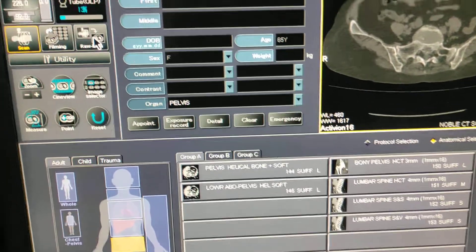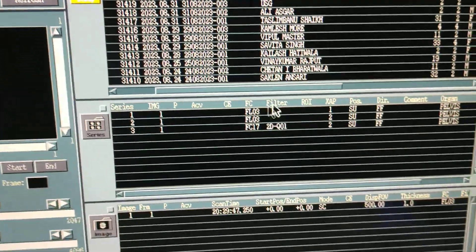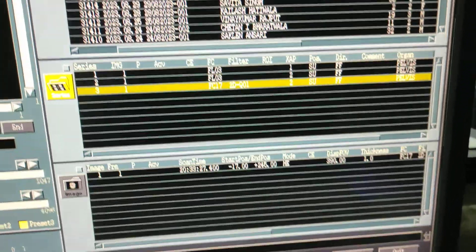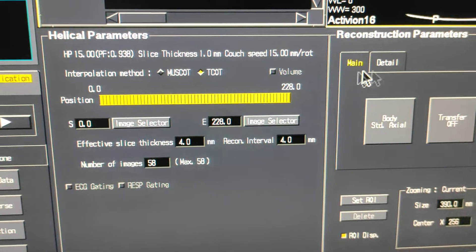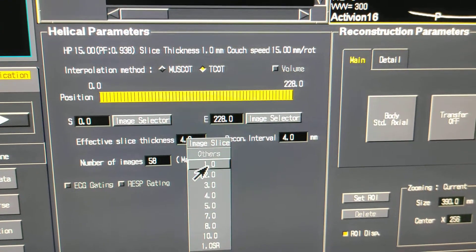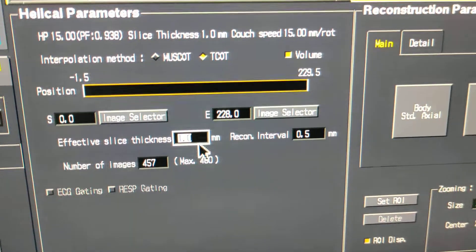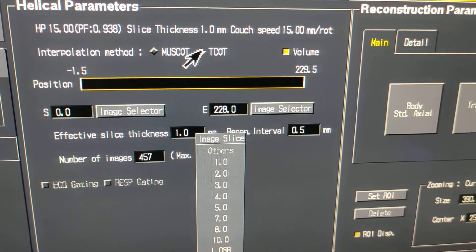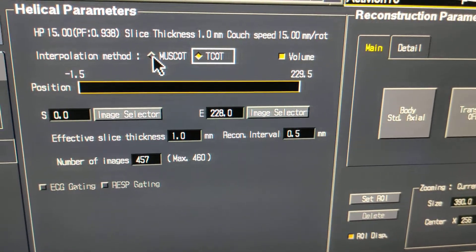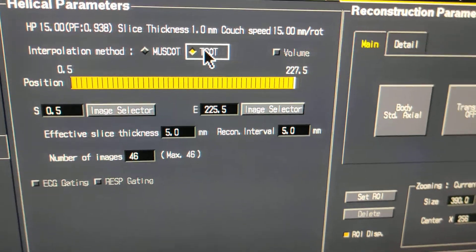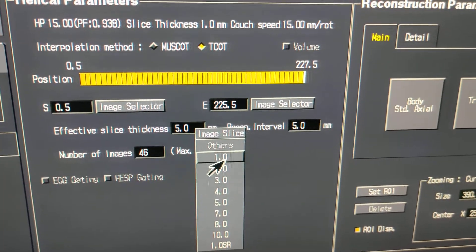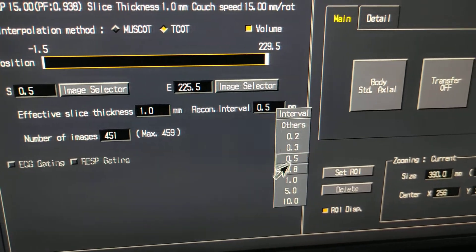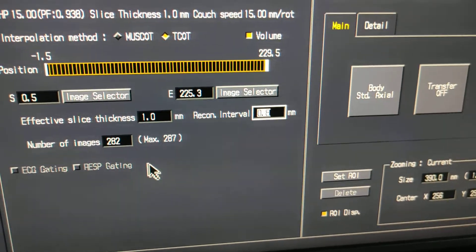To reconstruct, click on the raw data, then select the series and click OK. For routine images, click on 1 mm. Then you have to select TCOT — if you click on MUSCOT it will not process as fast, so click on TCOT at 1 mm. Keep the interval as needed.